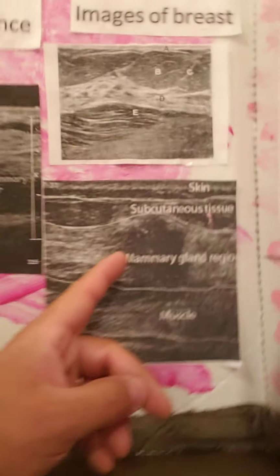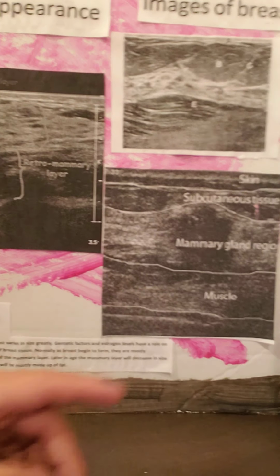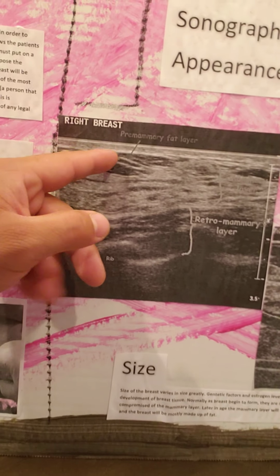And then we have here the sonographic appearance of the breast. Here we have the skin layer, which is the outermost layer, the subcutaneous tissue, which is the premammary layer, the mammary layer, and then the muscle, which is the retromammary layer. Here as well, as you can see, this is the mammary layer, which is brighter than the one behind it and the one in front of it.